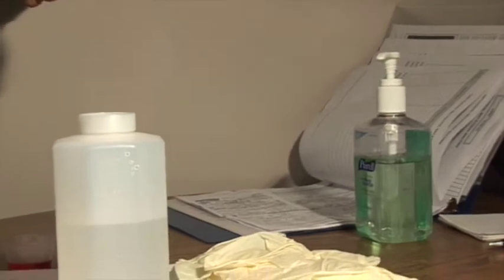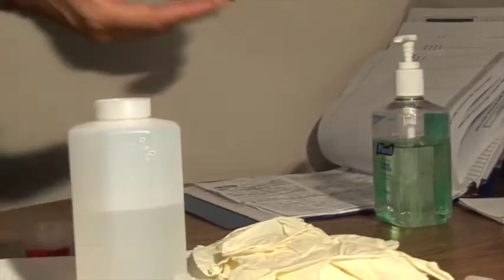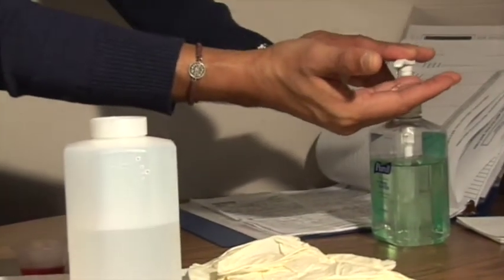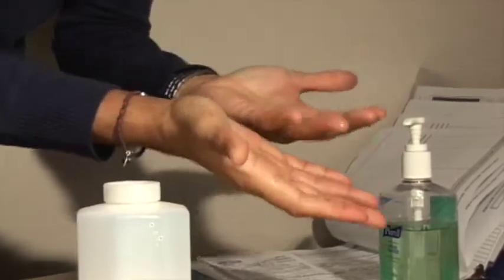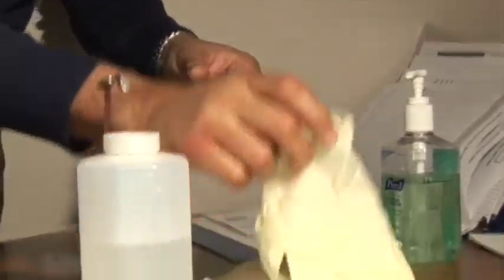I have already washed my hands with soap and water for 20 seconds, but because I touched a couple of things, I need to sanitize my hands — including wrists — and let them dry out. Then I put my gloves on.